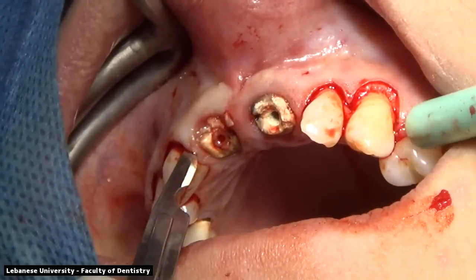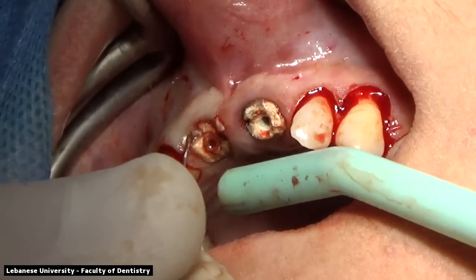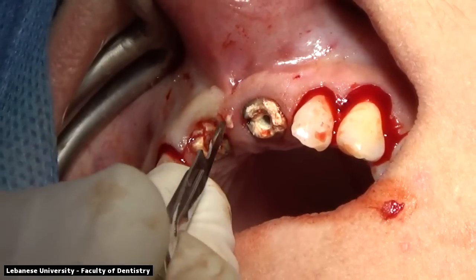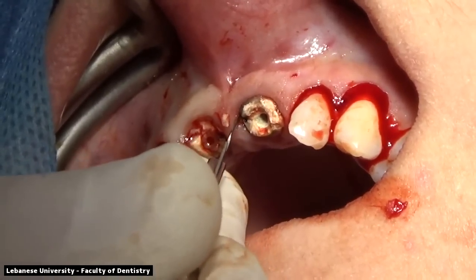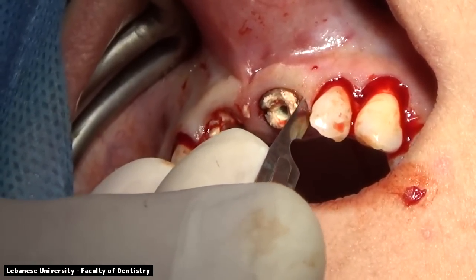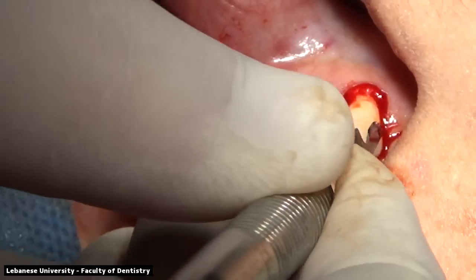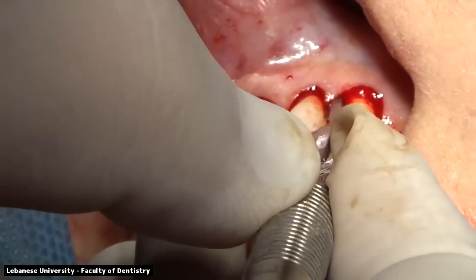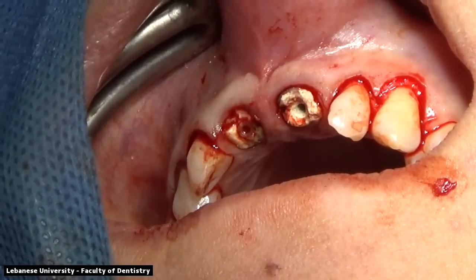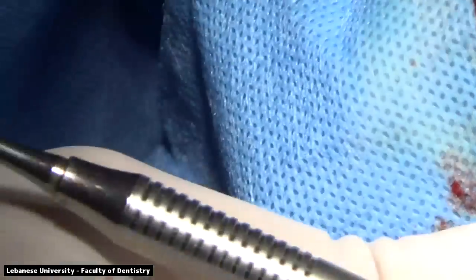We're now doing the intrasulcular incision to open our envelope flap. This will be a full mucoperiosteal flap. The flap will extend from the right canine side to the left canine side. Full mucoperiosteal flap, no partial thickness in this case. The papillas will be elevated with the flap itself.